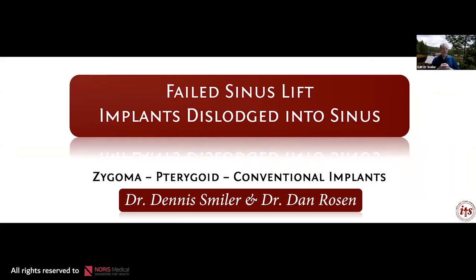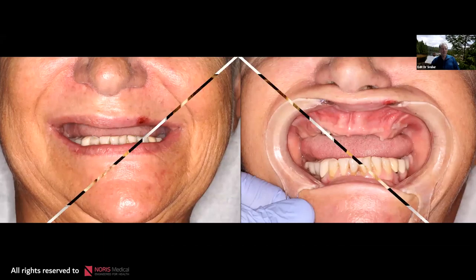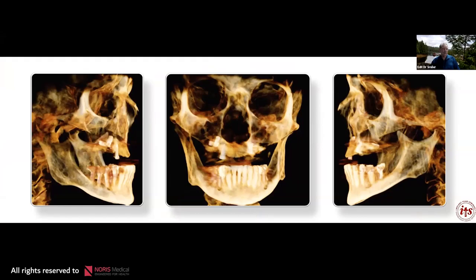This case was referred by a general dentist who managed to place two implants and dislodge them into the sinus on one side, and then also put the implants into the sinus on the left side. The patient came to us wanting a fixed appliance. This is an excellent case using zygoma and pterygoid implants with conventional implants. You can see the implants on both sides that are up into the antrum.